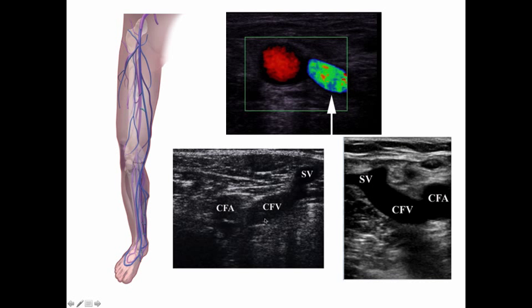But here there's a common femoral artery. The vein lies medial to the artery, right? So we're looking here at the right leg. The saphenous vein comes off medial and above. So this is on the right leg, this is on the left leg as it's branching in.